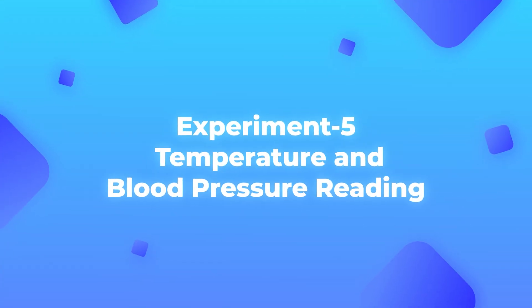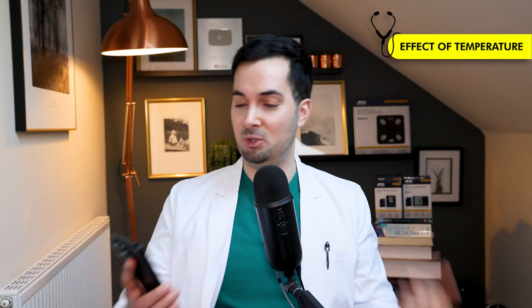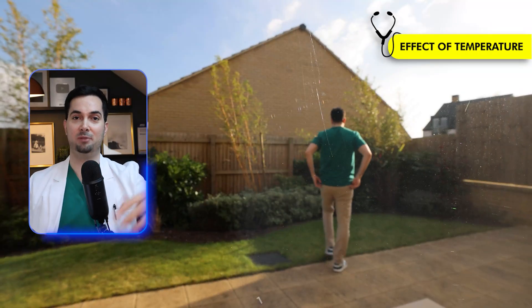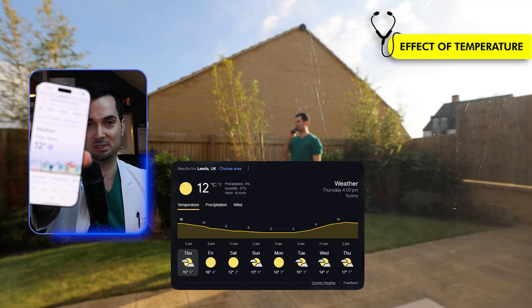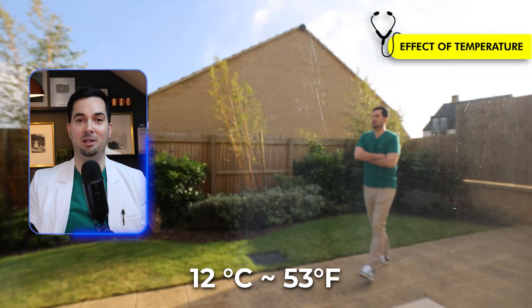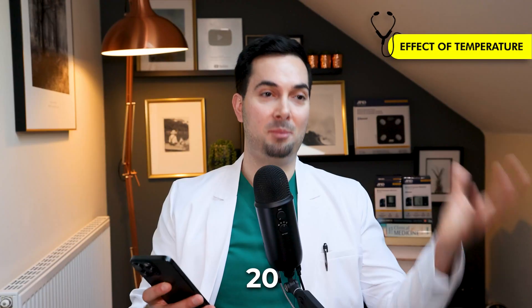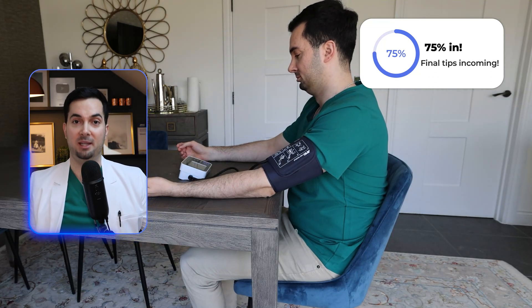Moving straight on to experiment number five — we're going to talk about temperature. This is one that not many medical providers actually know about. Basically, it's about maintaining a constant temperature in your home. If you take your blood pressure in a cold environment, your blood vessels constrict and blood pressure goes higher. I was outside for about 10–15 minutes to get cold. I'm in Leeds; the temperature is 12 degrees Celsius — that's 53 degrees Fahrenheit, quite cold. Then I came straight inside without giving myself time to adjust to the room temperature.